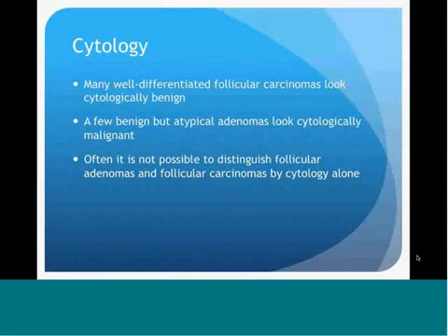However, that being said, many well-differentiated follicular carcinomas can look cytologically benign. And benign but atypical adenomas can look cytologically malignant. So there are definitely cases where you can't distinguish follicular adenomas and follicular carcinomas by cytology alone. That's why it's useful to have the ultrasound features.